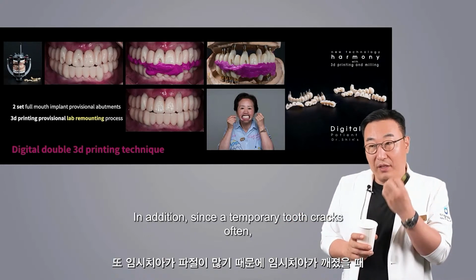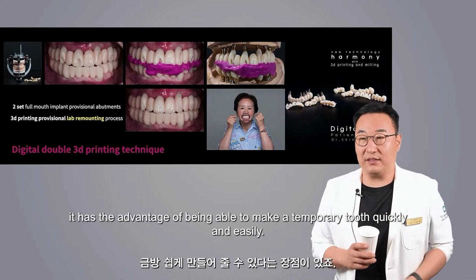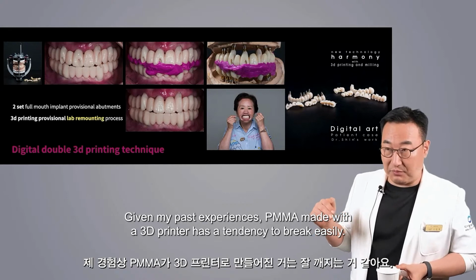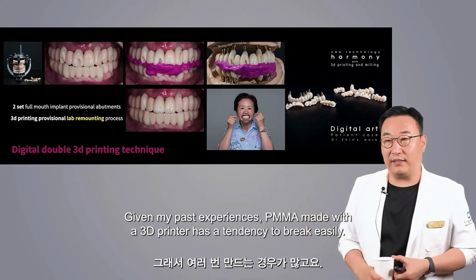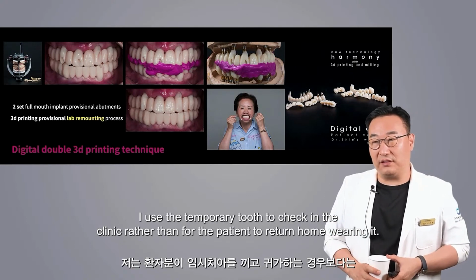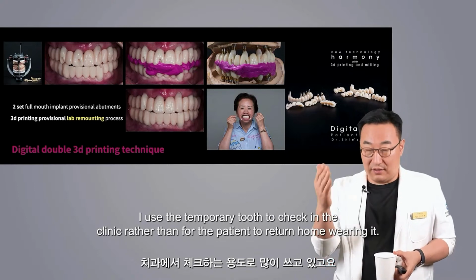In addition, since a temporary tooth cracks often, it has the advantage of being able to make a temporary tooth quickly and easily. Given my past experiences, PMMA made with a 3D printer has a tendency to break easily. So, I frequently have to make it several times. I use the temporary tooth to check in the clinic, rather than for the patient to return home wearing it.